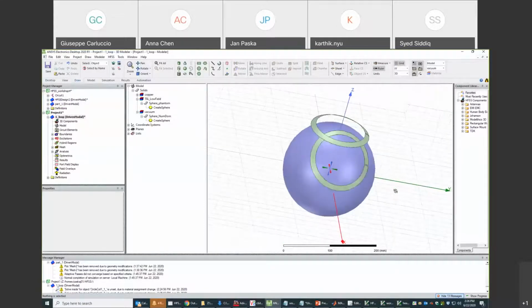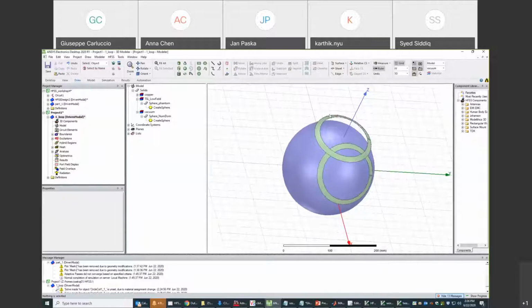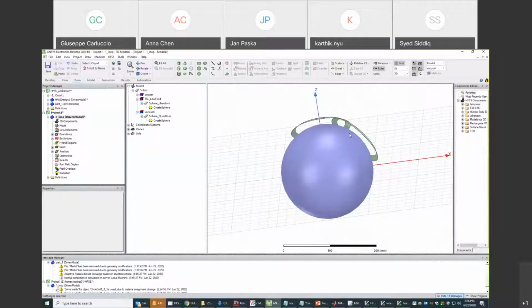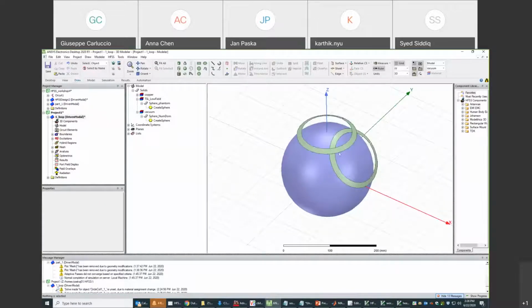It's very flexible, because I can create those coils very easily by just giving it two or three parameters for spherical coordinates, the width and the radius, and then those coils are created and wrapped around the sphere of the phantom. We can create different coil arrays to quickly test them. So this is the idea behind scripting. I just wanted to show you my approach, as an example. Do you have any specific questions about that?